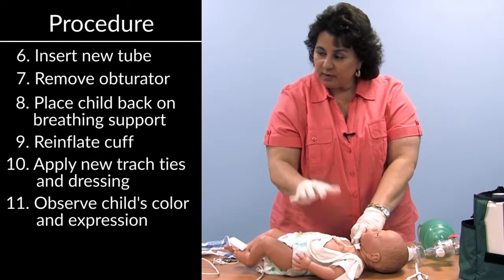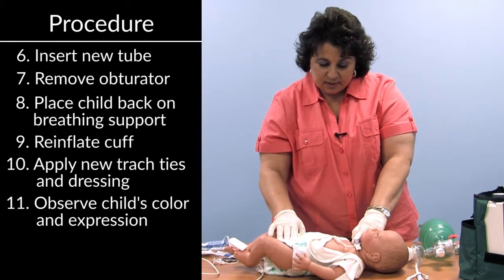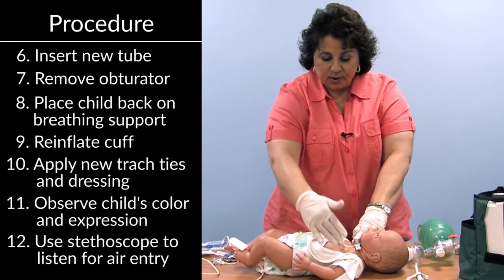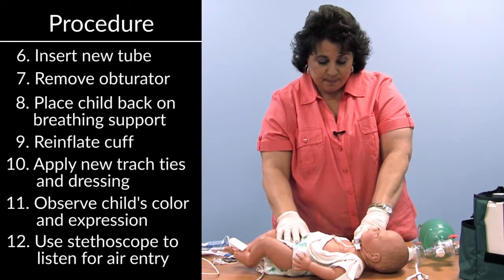We do want to observe coloring of the child, facial expressions. We would like to use our stethoscope to listen for air entry, if that's something that you're comfortable with and have in the home.